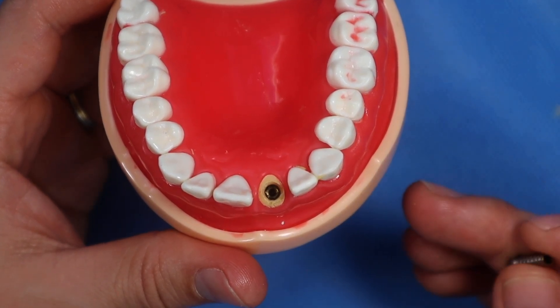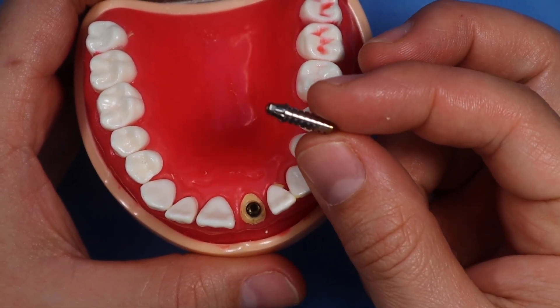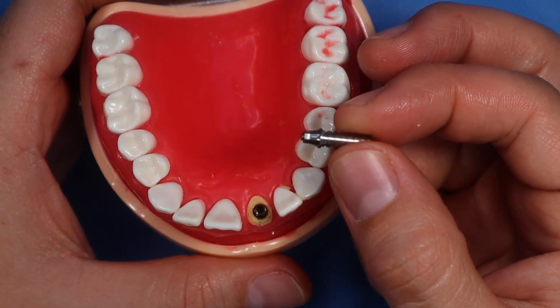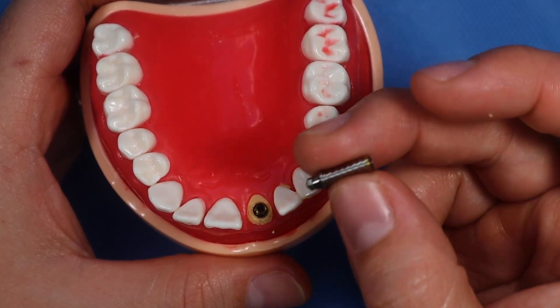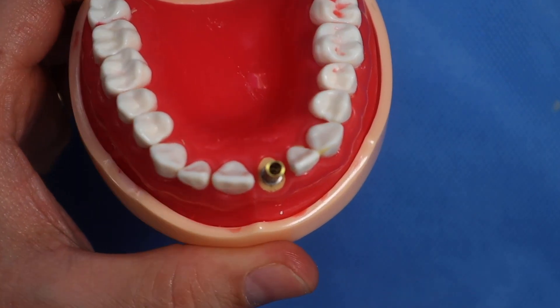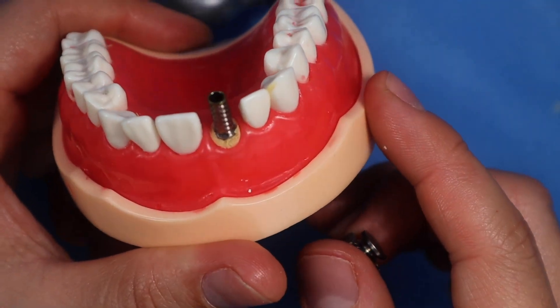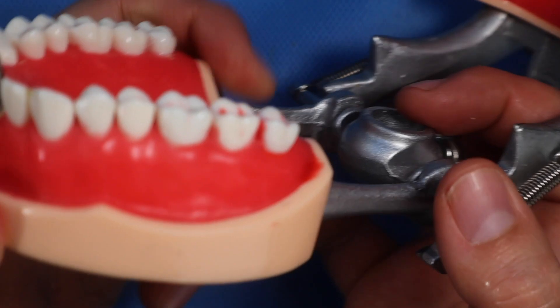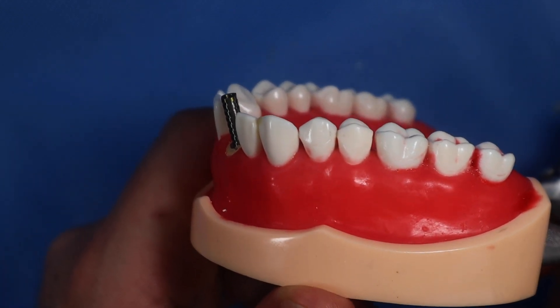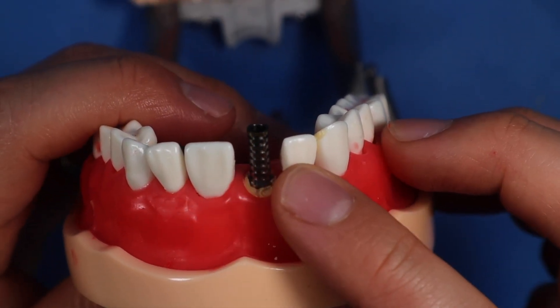If you want to proceed with the splint, we're going to get this temporary titanium abutment — it is engaging, meaning it has a little hex that orients your piece into the implant so it won't rotate. We'll go ahead and insert and tighten it. Now you can see it's not coming out through the facial aspect of the teeth — it's coming out of the cingulum. Maybe a little more lingual would have been fine, but it's pretty good. Now we have our temporary titanium cylinder in place.